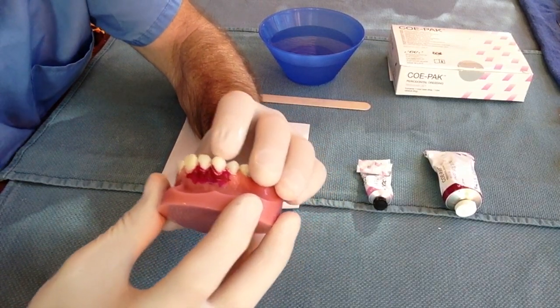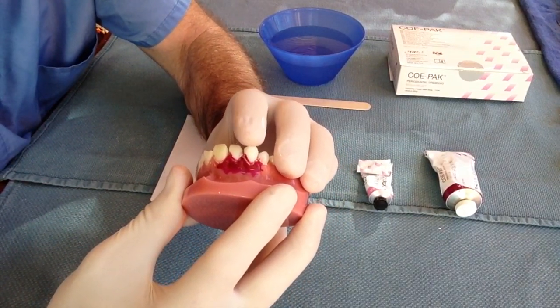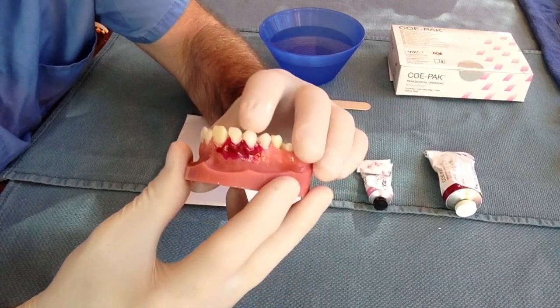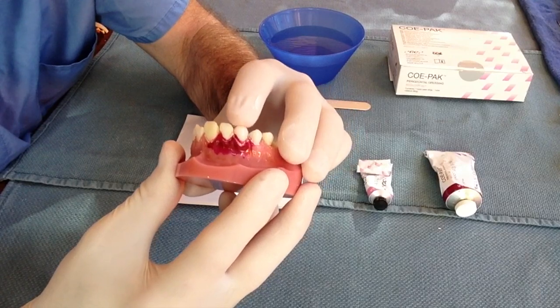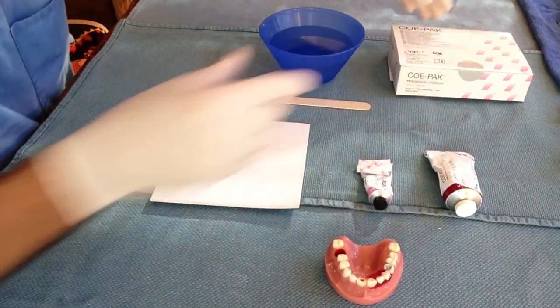Patients will present with subluxed or luxated teeth that may require stabilization. A minimally loose tooth does not require stabilization, as the periodontal ligament will reattach to the socket. A tooth that moves significantly with manipulation, however, like in this example, will need to be stabilized.